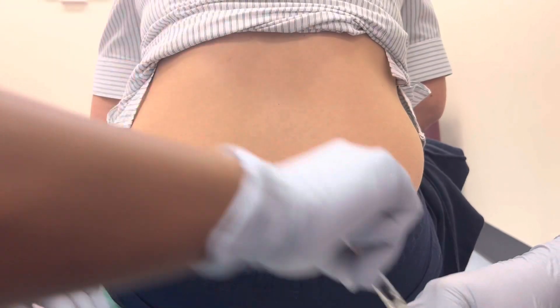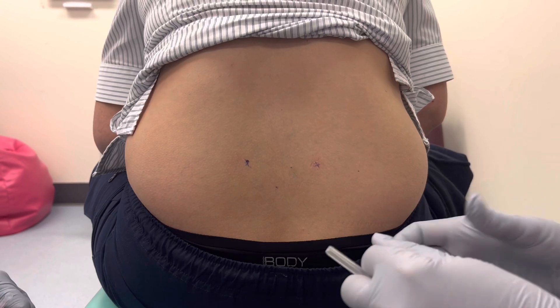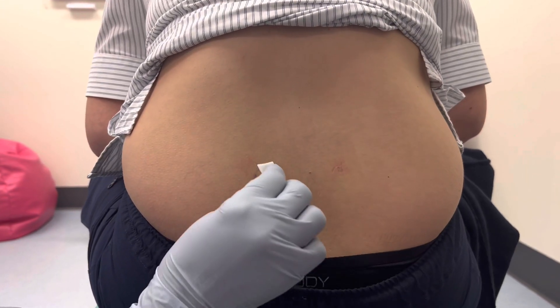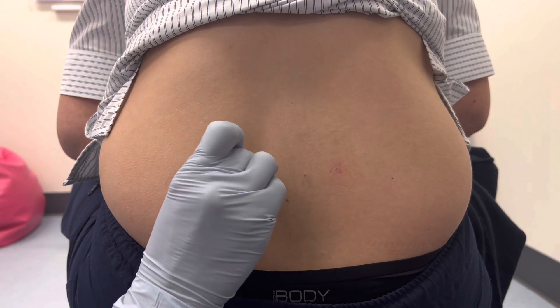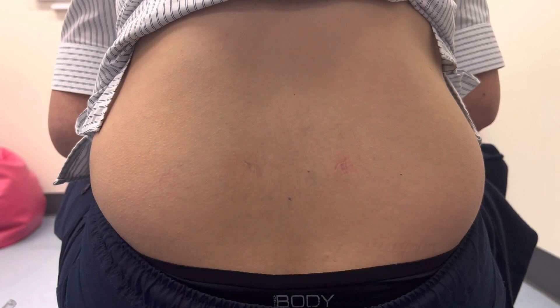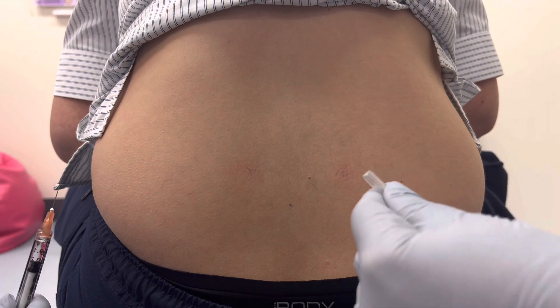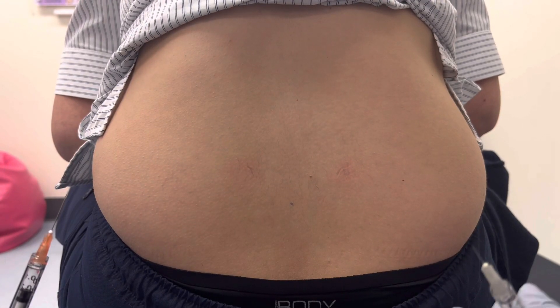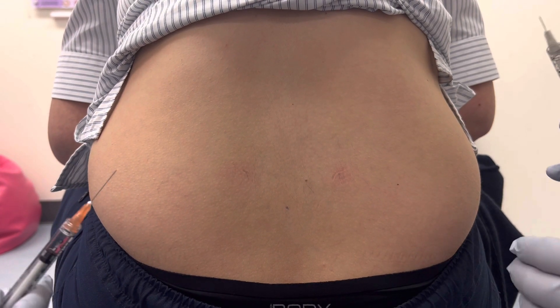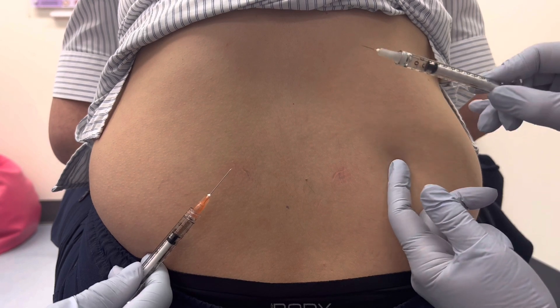Get your alcohol pad and wipe over the area. I like to use my fingernails because you can still see the mark after wiping. We've chosen to use 0.2ml of water for injection, and we've both checked that it is water for injection.